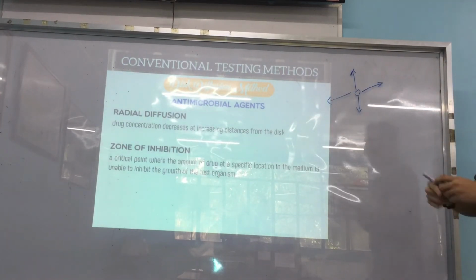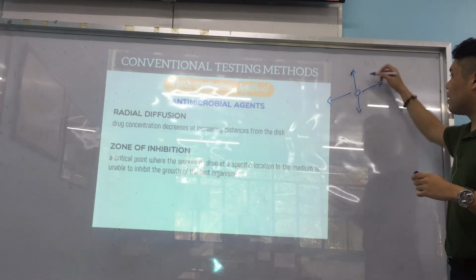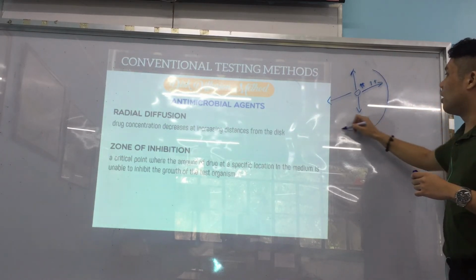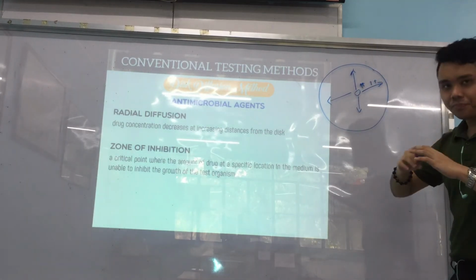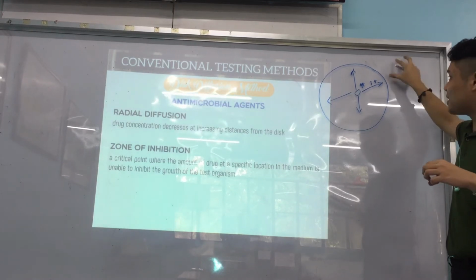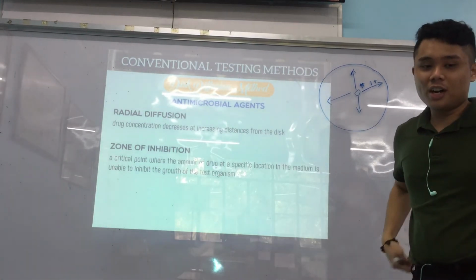And the zone of inhibition is dira ra gyud kutob, okay? Dira gyud siya taman ang effect sa imong antibiotic. So example, if taas ang concentration diri, magkagamay until dili na gyud siya mo effect, and dito na mag-start ang zone of inhibition. Okay? Gets ra? So ang disc again, pagbutang nimo dira, of course, sa duol niya taas gyud og concentration. Then magkagamay until dili na gyud mo effect ang antibiotic against the organism, munang mo form na siya og zone of inhibition. Kay unable na siya to inhibit. Muna siya, zone of inhibition or ZOI.